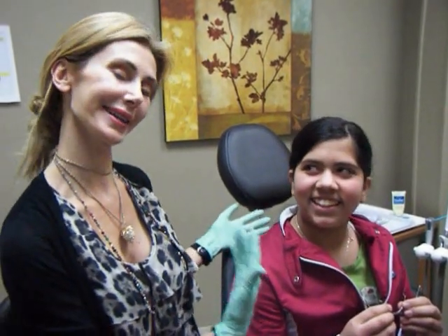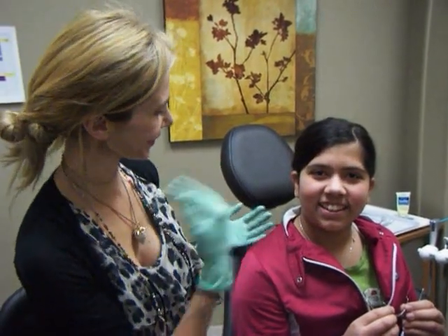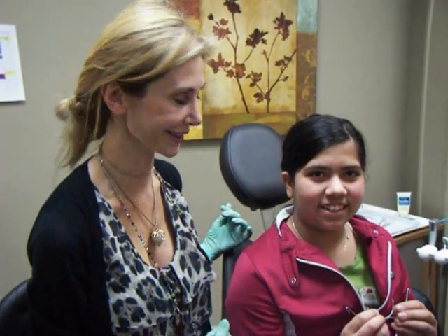Hi, I'm Dr. Suzanne Siraki, and today I have with me an 11-year-old young lady who's going to show us how she uses her headgear.